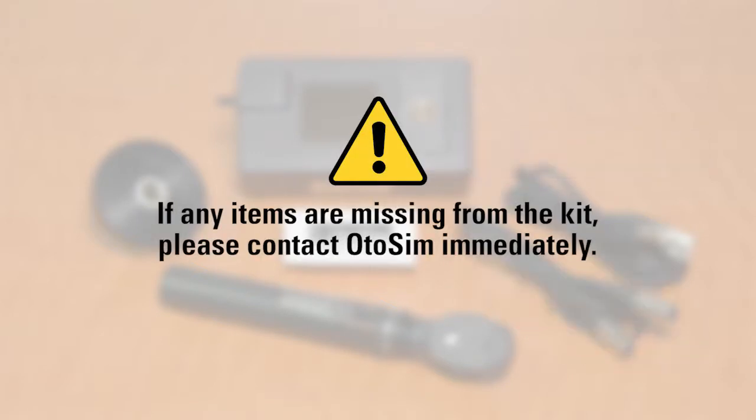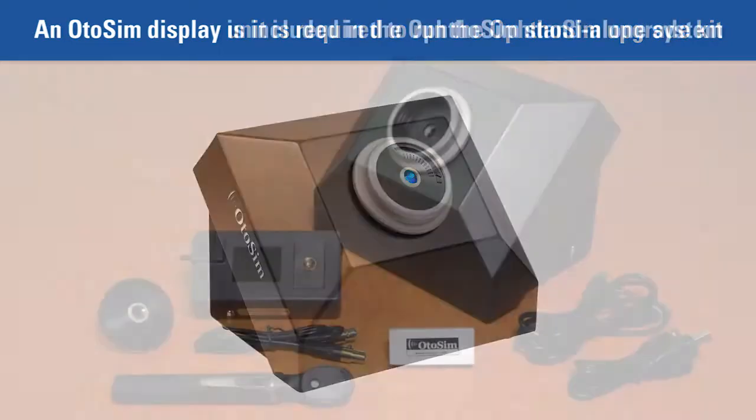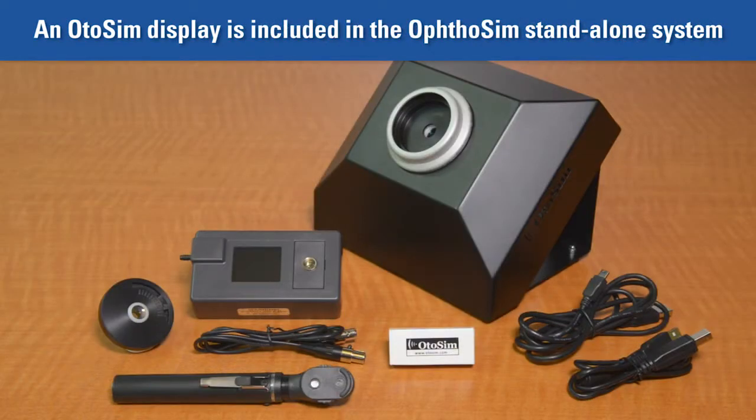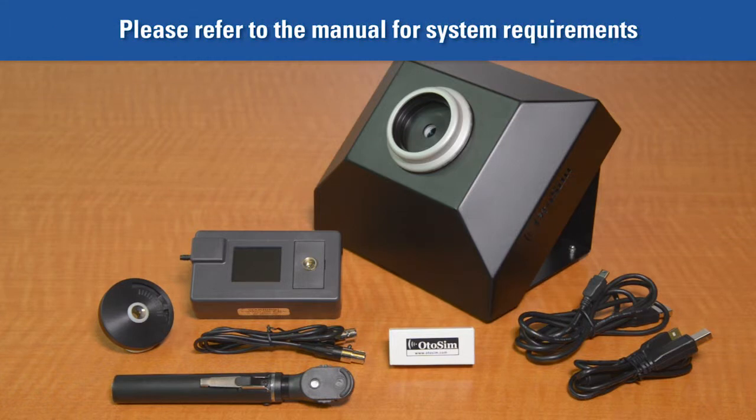If you did not receive all of the items shown here, please contact us immediately. Please note that you will need an OphtoSim display unit to run the OphtoSim upgrade kit. If you have purchased the OphtoSim standalone system, you will receive an OphtoSim display unit in addition to these other components. You should also note that a computer is required to run the OphtoSim but is not provided. Please refer to the product manual to learn about system requirements for a suitable computer.